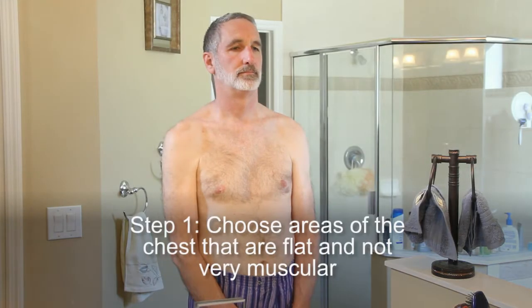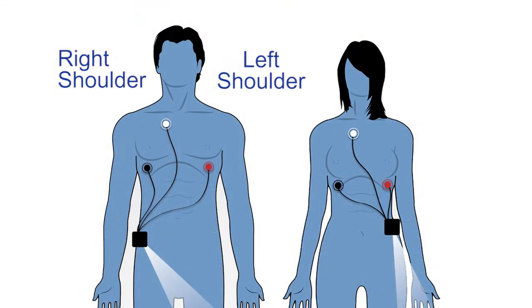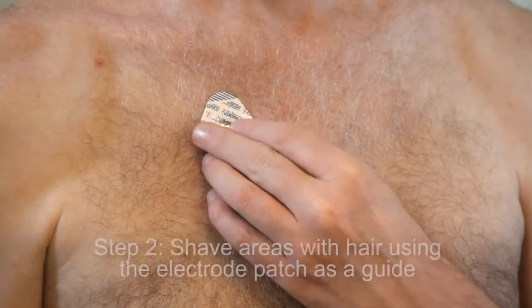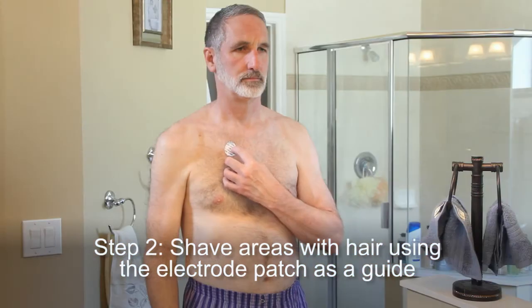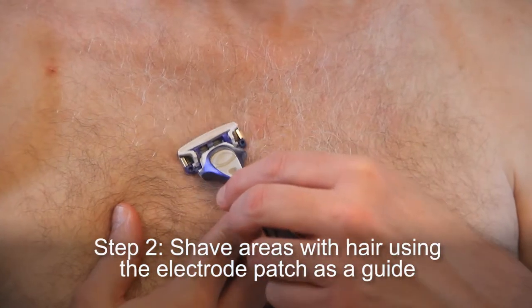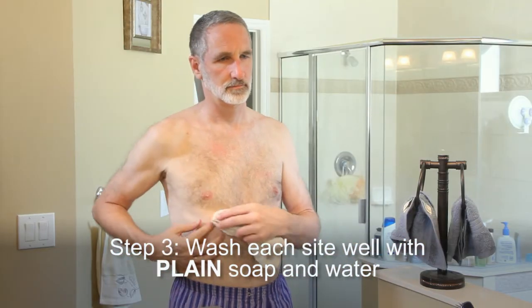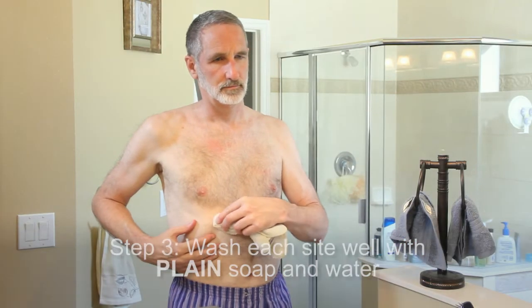Step 1: Choose areas of the chest that are flat and not very muscular within the areas indicated on the illustration. Avoid skin folds or creases, irritated skin, and scars as best as possible. Step 2: Shave areas with hair using the electrode patches as a guide for the size of area to shave. This ensures good contact and makes electrode removal easier. Step 3: Wash each site well with plain soap and water — do not use soap that contains lotion or oil. Dry thoroughly.